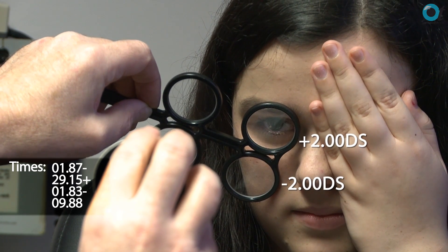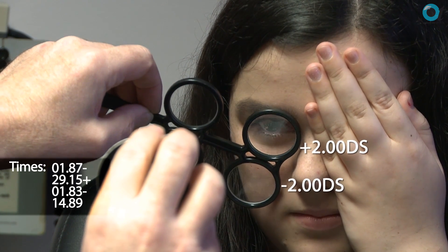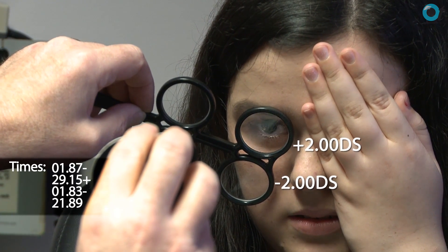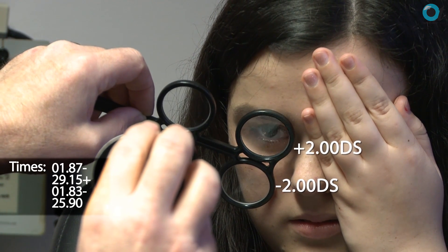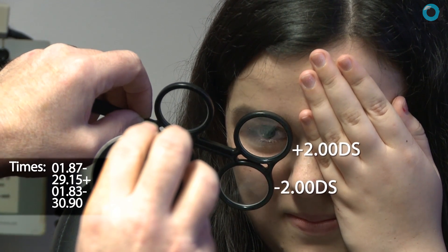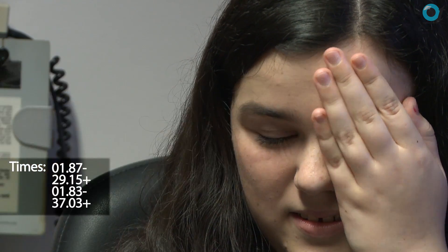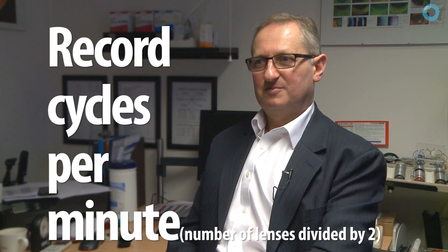Flip it over, ask them to look through the plus two lens, and they will release the two diopters from the minus two, plus another two. It's very important to do this at no greater than 40 centimeters, otherwise the patient will not be able to make the text clear. You then record how many times the patient can flip between minus two and plus two, making it clear in one minute. The easiest way is to count the number of lenses they look through and divide by two.